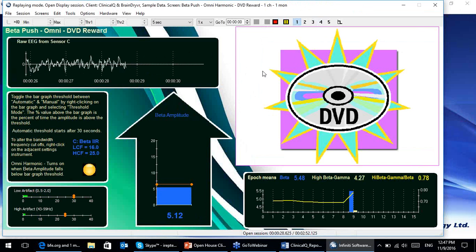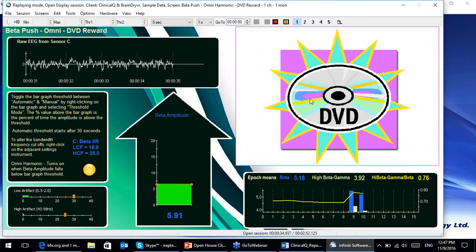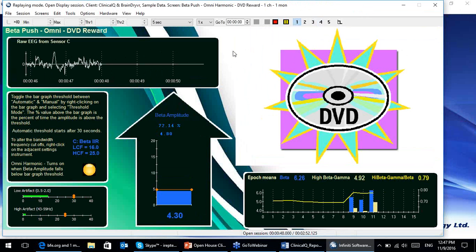There's a very exciting feature that takes advantage of this DVD where, don't tell anyone I told you guys yet, the DVD is going to be able to link to any video online from YouTube or any other site. And so you'll be able to stream directly any YouTube video into your feedback system to do feedback with just a YouTube video. The system will remember these YouTube links, and it's automatically going to be able to pick them out depending on what you want.